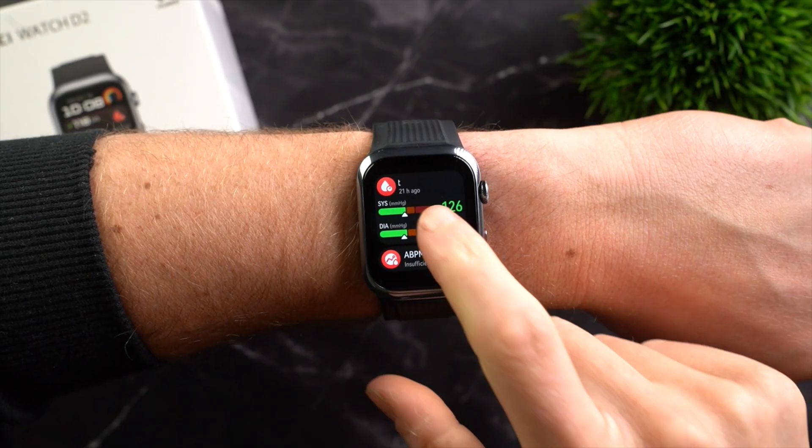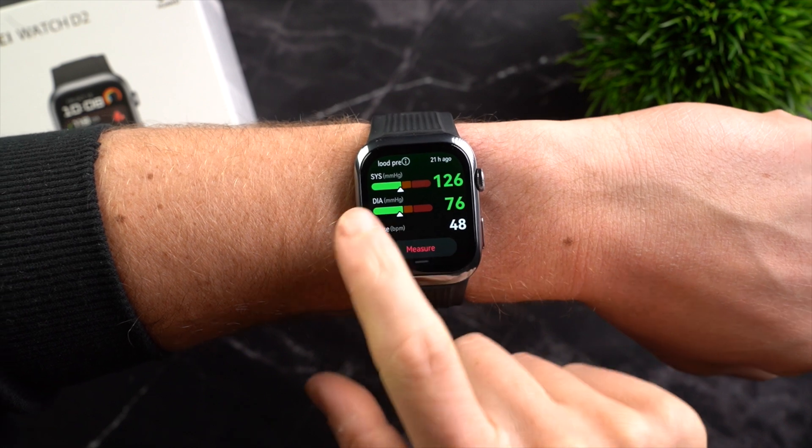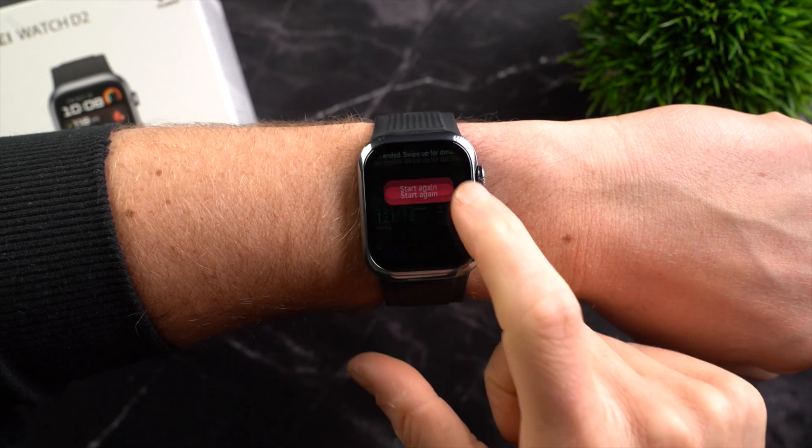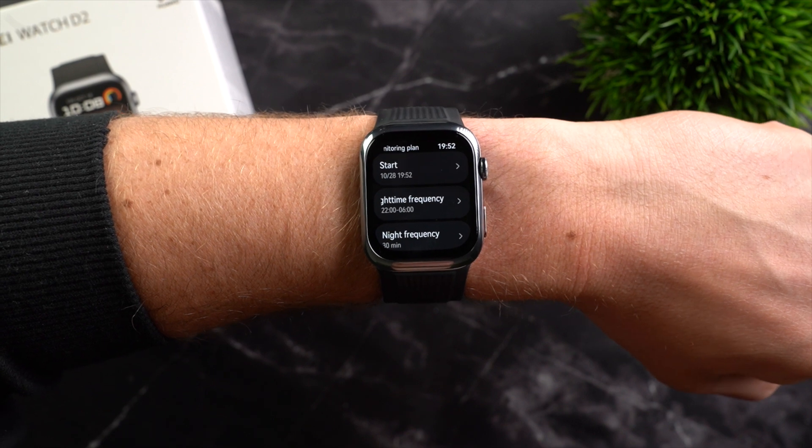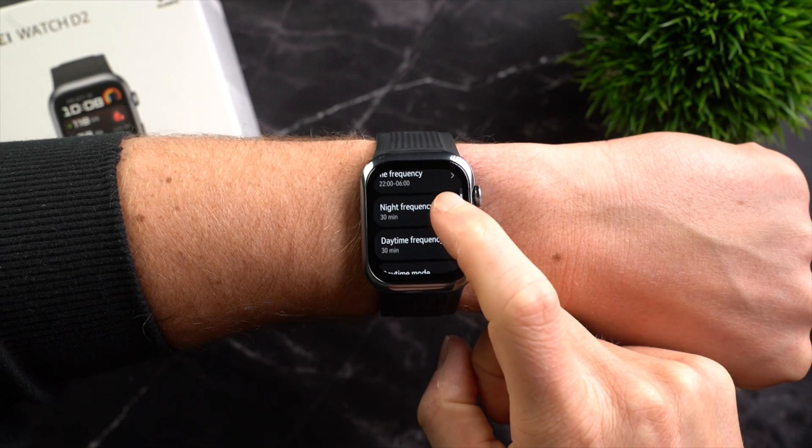If the values for you are significantly higher, it's essential to see a doctor regardless of the measurement method used. But based on my personal experience, the Huawei Watch D2 is accurate and yields results similar to an arm cuff. You can either manually start the measurement by clicking measure, or activate an automatic 24-hour monitoring plan where blood pressure is measured at intervals throughout the day and night, which you can set yourself.